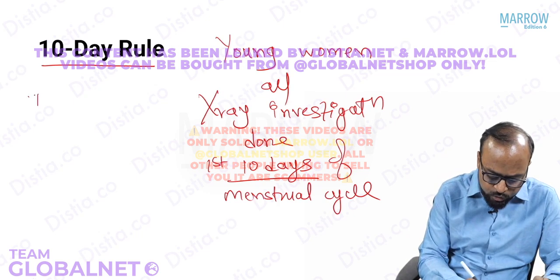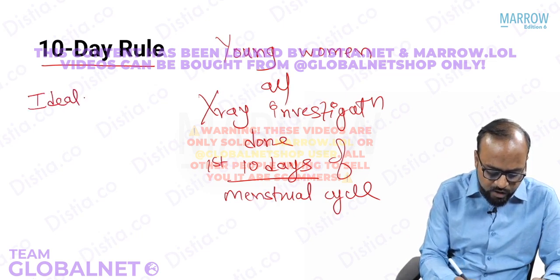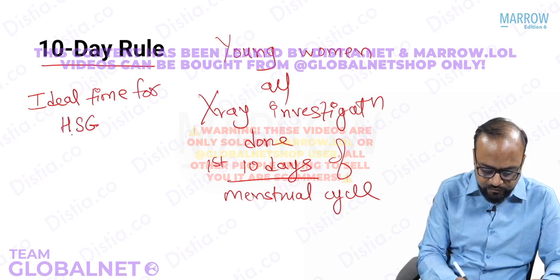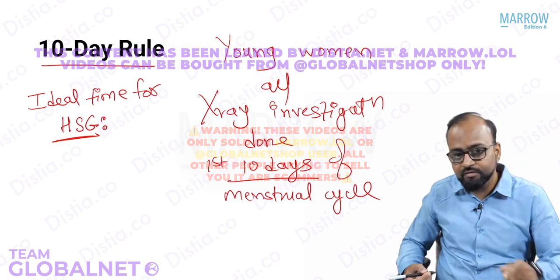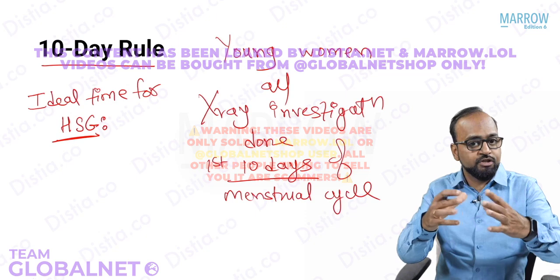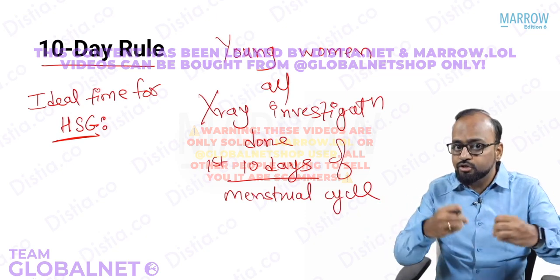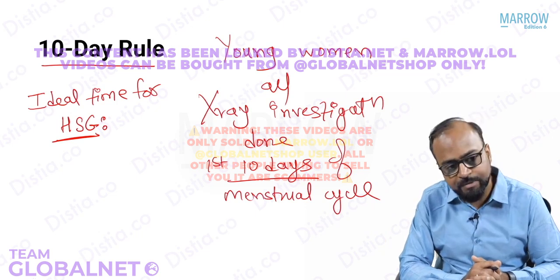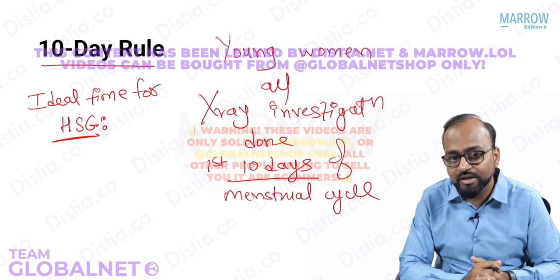The question was, what is the ideal time for doing a hysterosalpingography? What is hysterosalpingography? We cannulate the cervix and inject contrast. This contrast will opacify the uterine cavity and fallopian tubes. It will spill into the peritoneal cavity. That is how we ensure that the tubes are patent. So what is the ideal time for doing HSG?